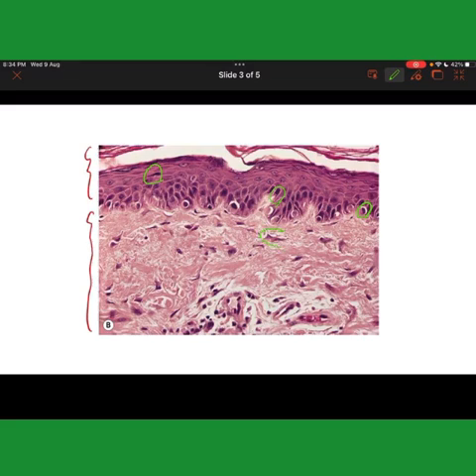We tend to find stellate fibroblasts and dendritic cells in the upper dermis. Not only that, we even find vessels which are telangiectatic. What do you mean by that? These are dilated vessels which we usually find in the upper dermis in sun damaged skin.